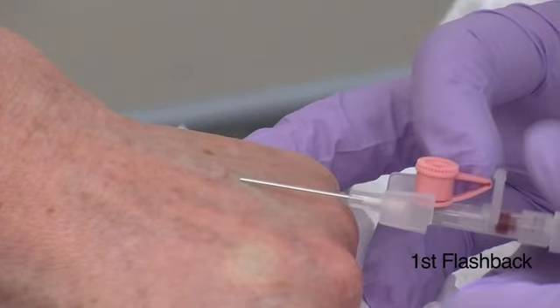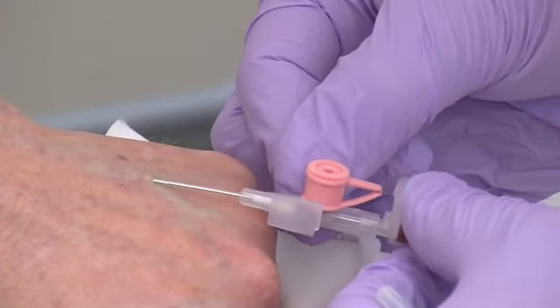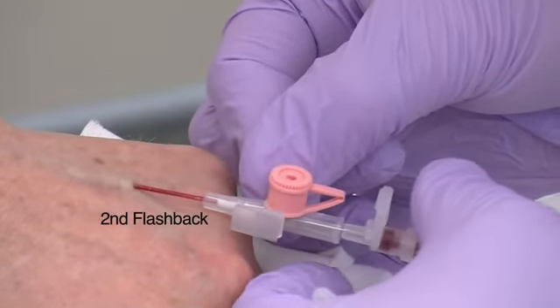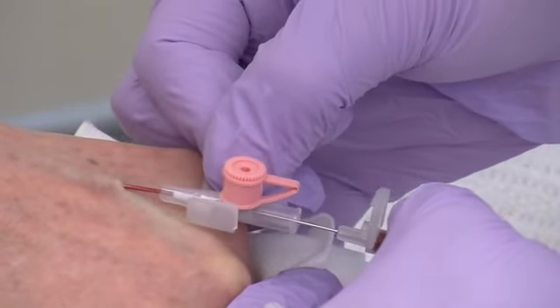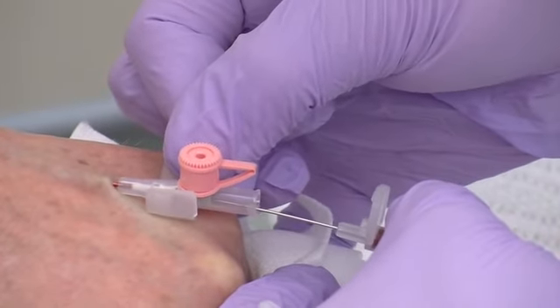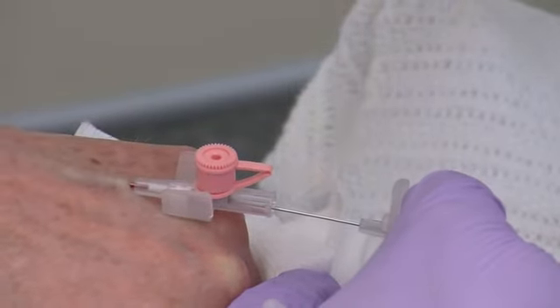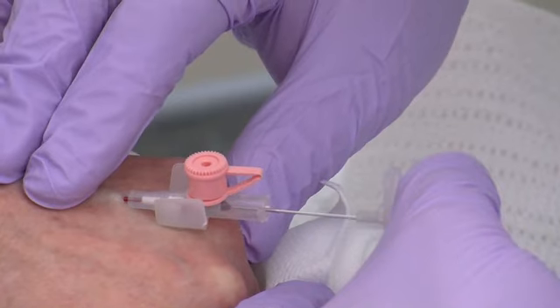A flashback should be seen when the needle enters the vein. When this occurs, withdraw the needle from the cannula by a few millimetres until a second flashback is seen along the cannula shaft. Gently advance the cannula into the vein in a smooth, continuous motion. If insertion is successful, apply light pressure over the vein above the tip of the cannula whilst carefully withdrawing the needle.